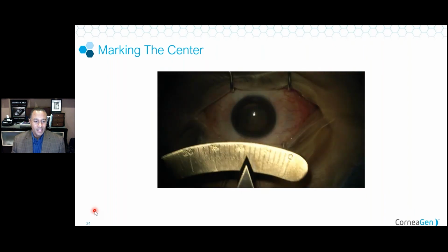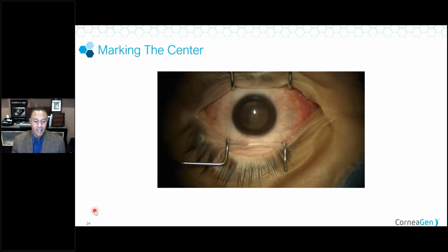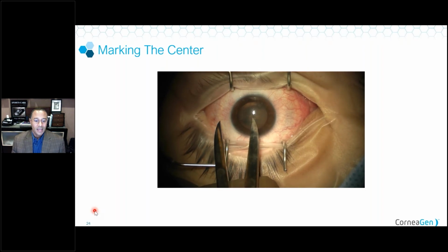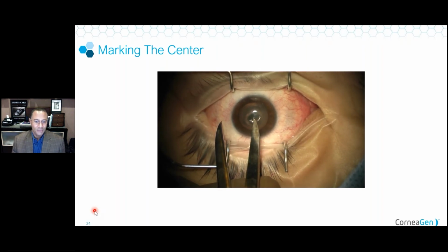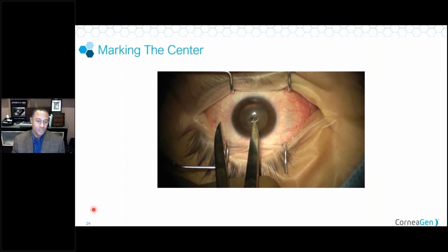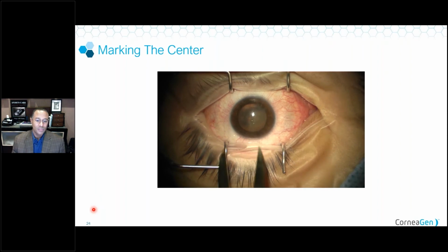In this slide here, you'll see me using the caliper to choose my 8.5. Then I mark the center. I just do that visually. I don't usually try to measure to find the center. I used to do that, but I find that just eyeing it really gets you very close to the center. We're very good at picking out the center of circles. So I usually do that at least to start. Next slide.